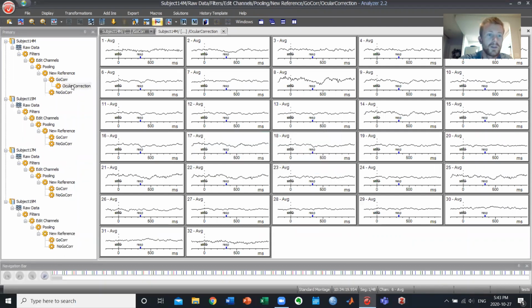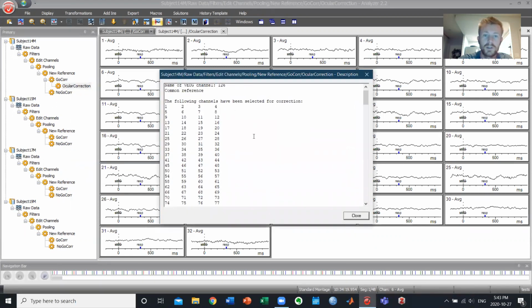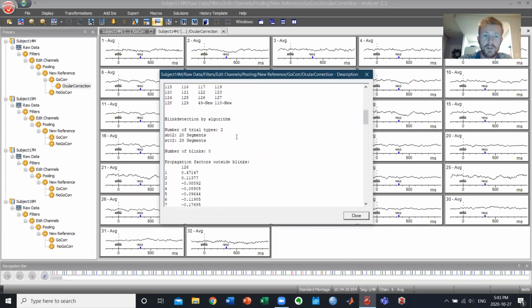So once this is done, I'm going to go into operation infos and see how many blinks there were. Used my reference channel. All these channels were looked at, 20, 28, and there was no blinks. Okay, so it could be.